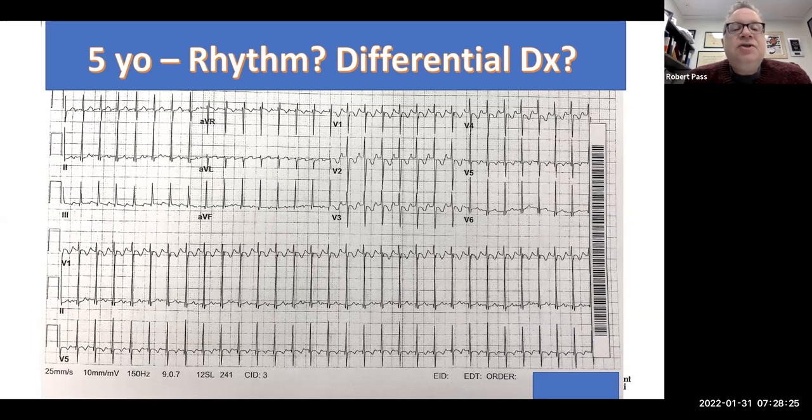So just so we take a step back, when we say a long RP tachycardia, what is usually meant is an RP interval that is like this, greater than 150 to 200 milliseconds. You're thinking about it in terms of what I've explained to you, which is that in AVNRT, the RP interval is less than 70 milliseconds, and in ORT, it's greater than 70 milliseconds. But that is not generally what is thought of as a long RP interval. Long RP is like this. It's like an RP interval of about 200 milliseconds or greater.